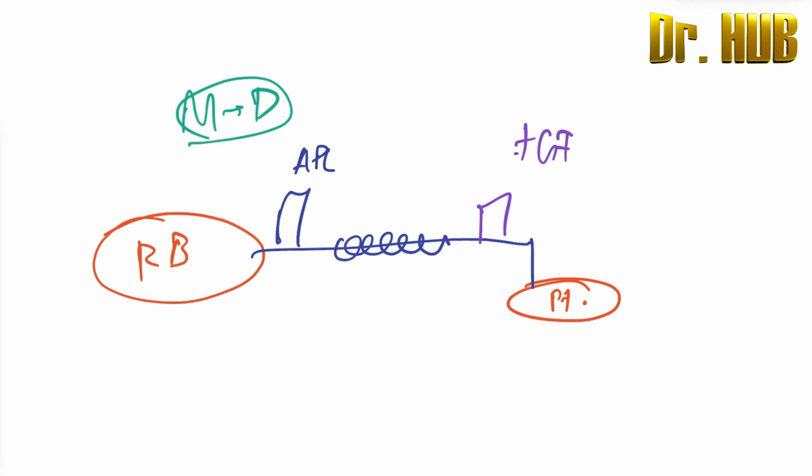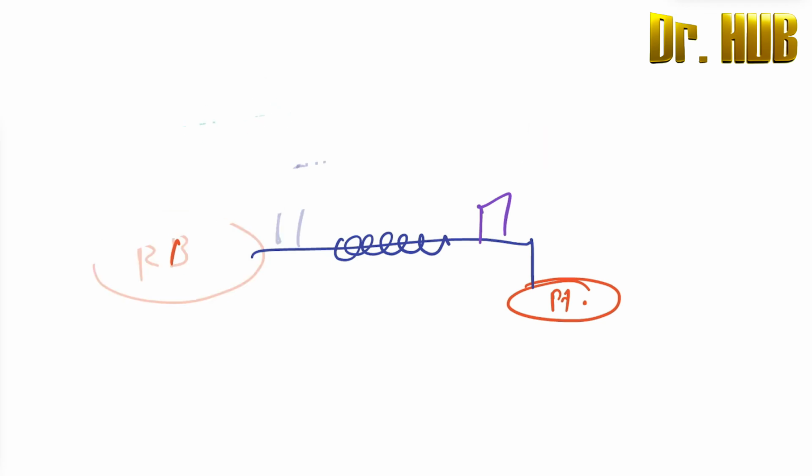FGF is the fresh gas flow, which is towards the patient side. So there is complete reversal here compared to that of the A. Next we'll move on to the E, the circuit E.